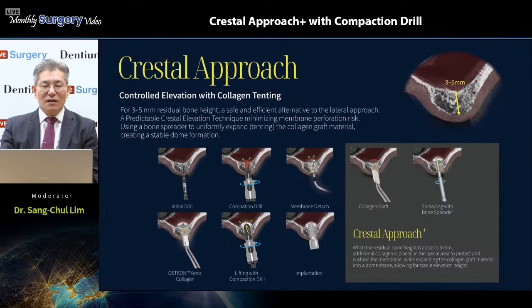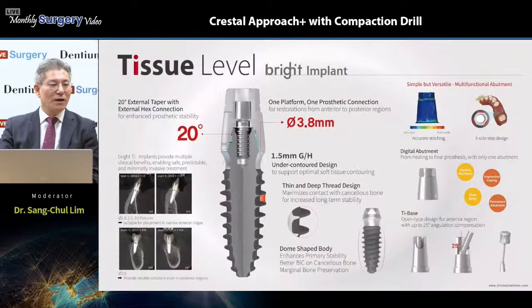The sinus will be elevated upward, and then finally insert the implant fixture. Okay, all these procedures are named crestal approach plus.